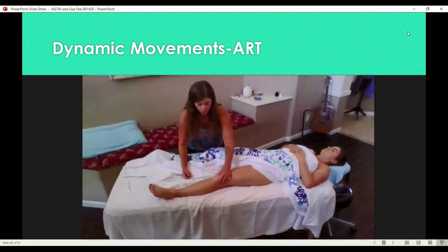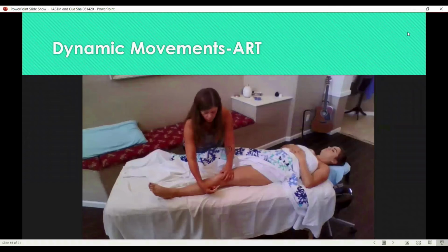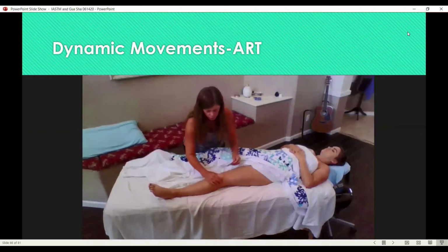Okay, here I'm showing the patella, and without a bolster, we can mobilize the patella. And here I am sliding the patella medial and lateral and working underneath the patella. Sometimes we can get on each edge, but we can't really get under. It's kind of the equivalent of when we put somebody's arm behind their back to get under their scapula and work on the subscapularis area.